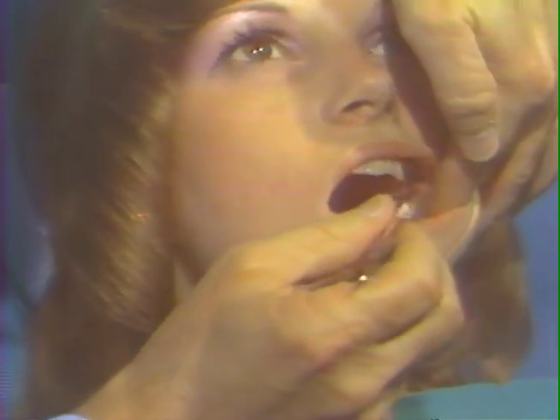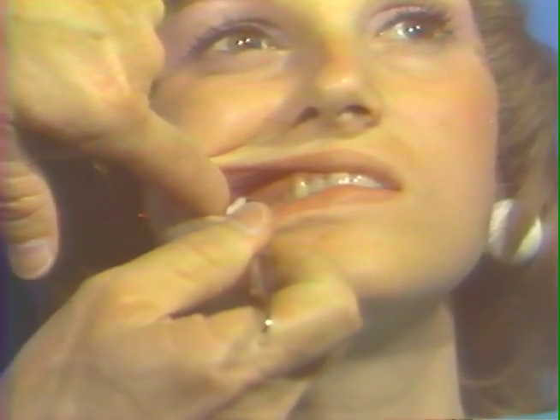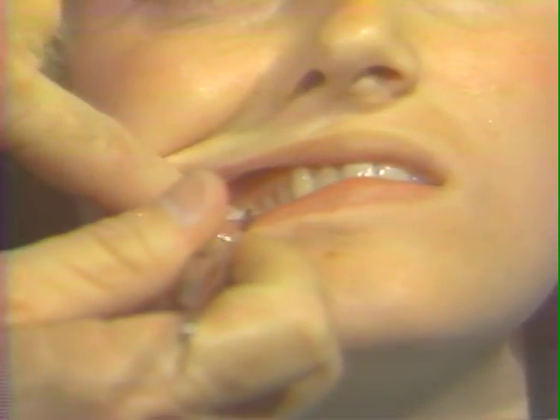Now open once again. To produce topical analgesia for injection of the long buccal nerve, right and left, place the cotton roll in this manner. Now open. Let me pull your cheek. Place it to the buccal side of the molar teeth slightly so that the patient can engage it in their teeth. Now close your teeth together. It now lies over the course of the long buccal nerve as it comes across the coronoid notch into the buccal sulcus. Now open once again.